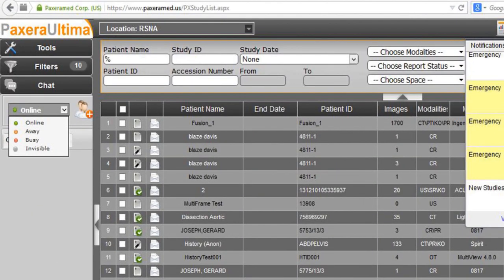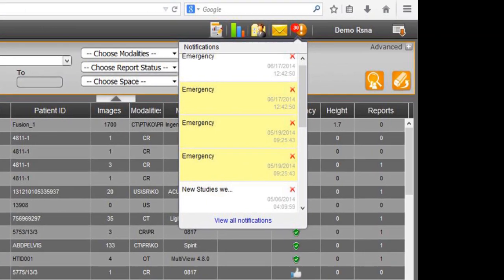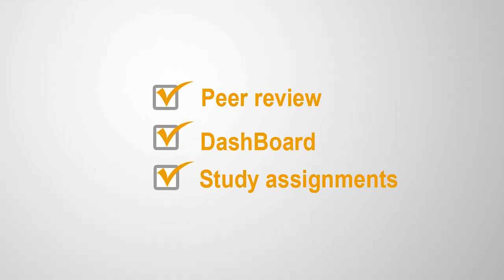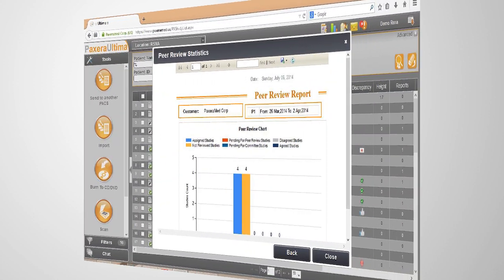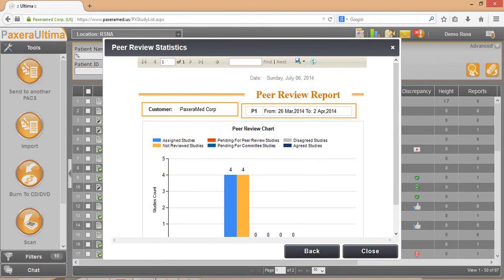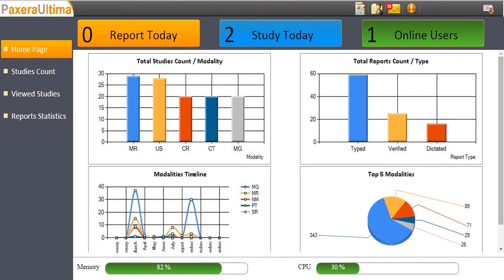Paxera Ultima incorporates advanced collaboration tools, including an online instant chat with the ability to share studies with peers, and a built-in notification and messaging module. The Worklist screen enables easy access to an advanced peer-review module that is incorporated into the daily clinical workflow, a sophisticated dashboard, and one-click study assignment.